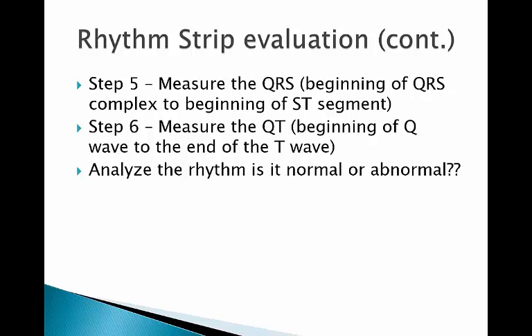So then, analyze the rhythm. Normal or abnormal? Is it normal sinus rhythm or is it some kind of dysrhythmia? And when you are asked about analyzing a rhythm on exams, you need to identify the rhythm. Not whether it's normal or abnormal, not whether it's regular or irregular, but what the rhythm is.